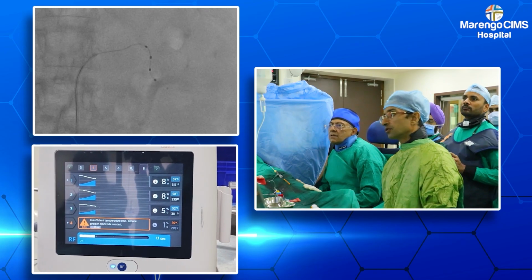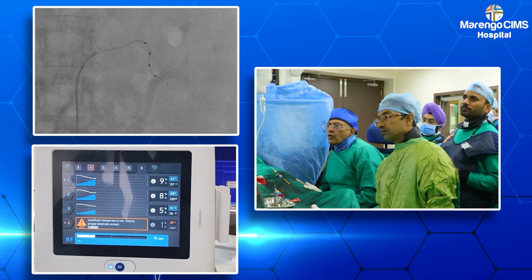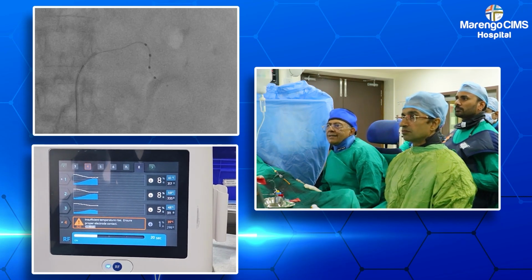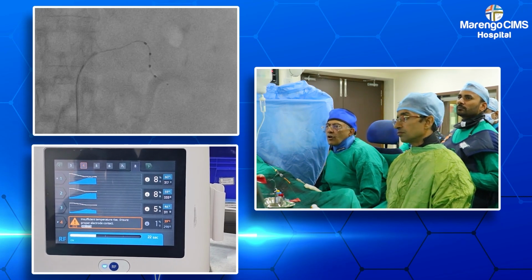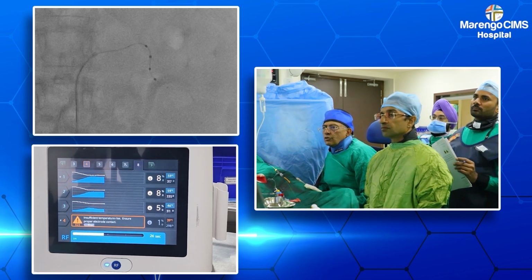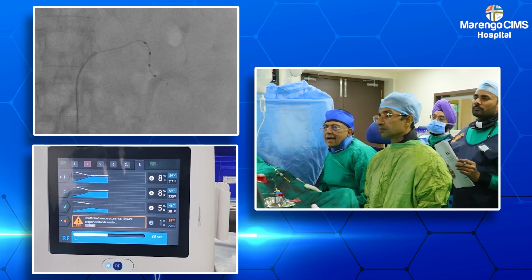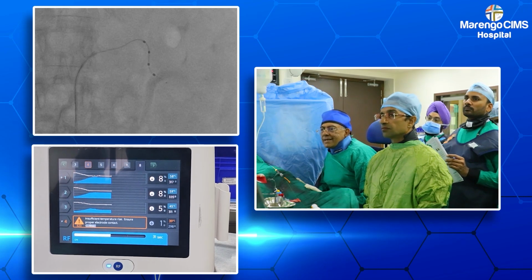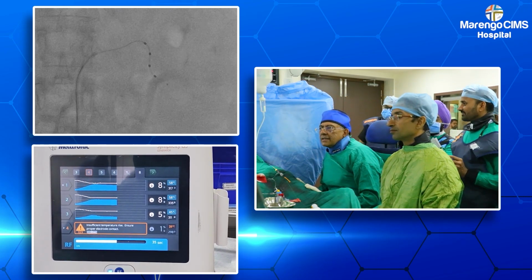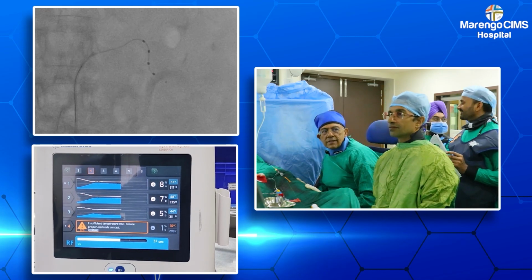Insufficient temperature. So we are finding that the 4th electrode, which was at the borderline zone, is showing insufficient temperature rise and automatically shut off. So we were debating earlier not to use that electrode. So the AI decided to agree with me. So my intelligence and AI intelligence coincided and it has shut off itself.